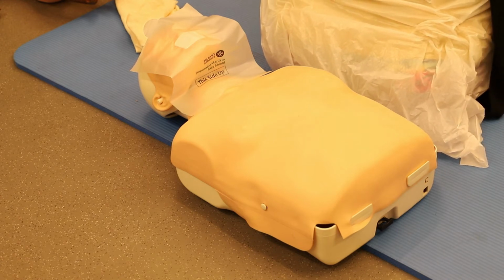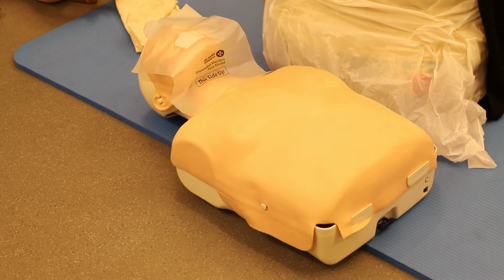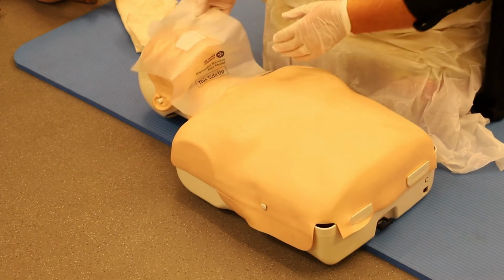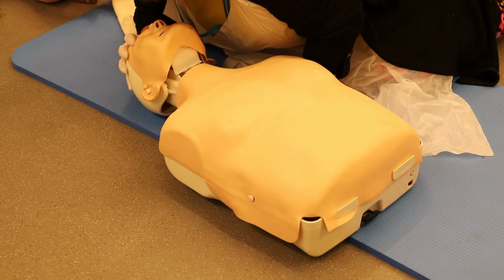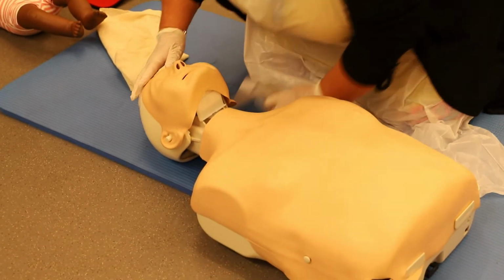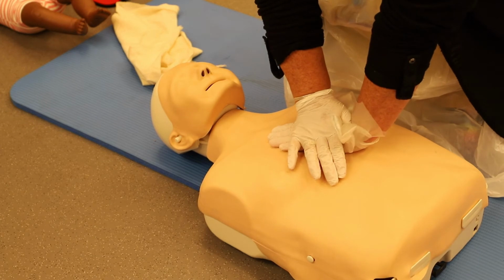Okay? So once again, we're going to start from the beginning, and when I call for the help this time, I will call for my assistant to bring in the defib. Okay? So I've checked for danger. I'm checking for response. Hello, can you hear me? I'm opening the airway, looking and listening for 10 seconds. 1, 2, 3, 4, 5, 6, 7, 8, 9, 10. Not breathing. Hello, can you help me? Call for the ambulance, and can you bring me the defib, please? And then I will continue with my chest compressions.